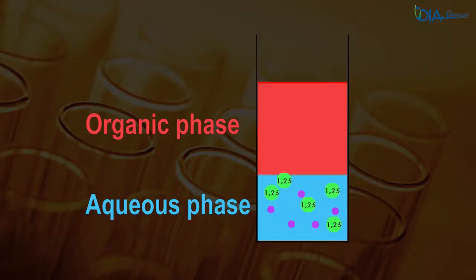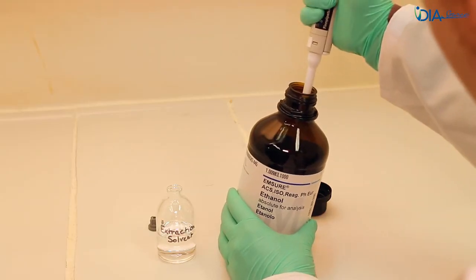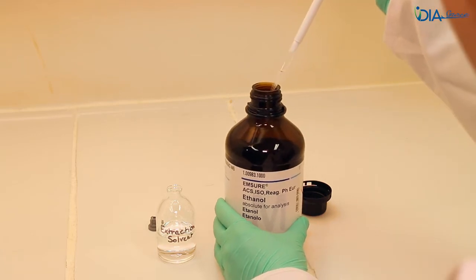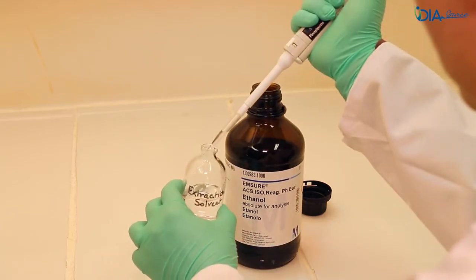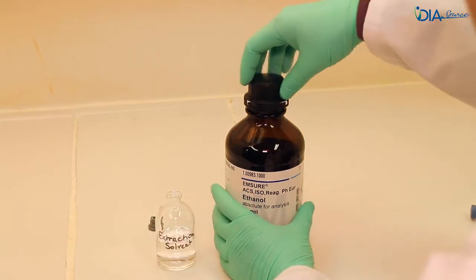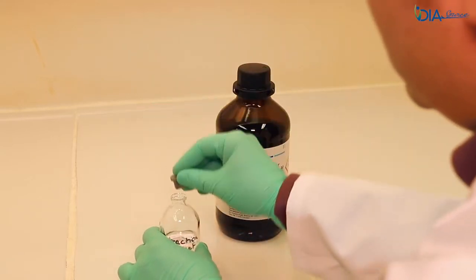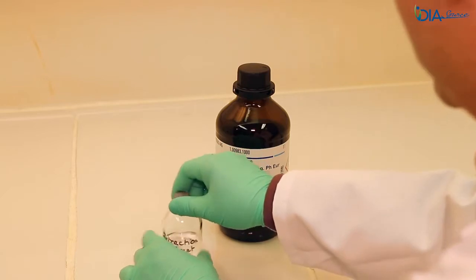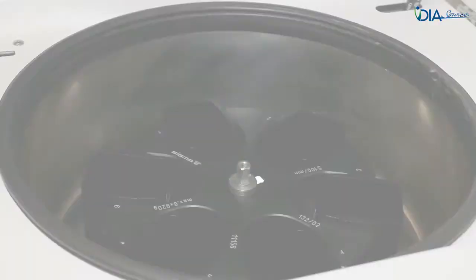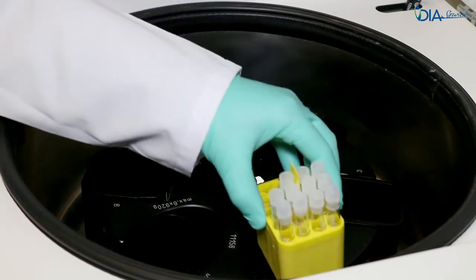1,25-dihydroxyvitamin D and other molecules soluble in the organic phase are being extracted from the sample. During the one-hour shaking, prepare the washing solvent by adding 1% high quality ethanol into the remaining volume of the extraction solution. Pre-saturate the tip to ensure an accurate volume. Transfer the extraction tubes into the centrifuge racks and centrifuge for 5 minutes at 800 g. Respect carefully the 800 g during all centrifugation steps of the protocol.